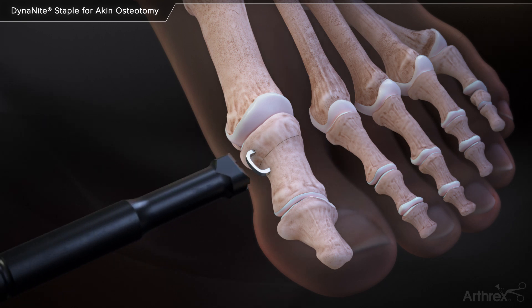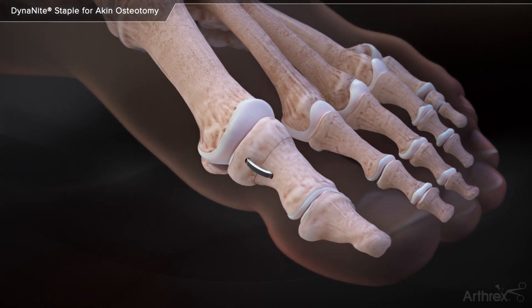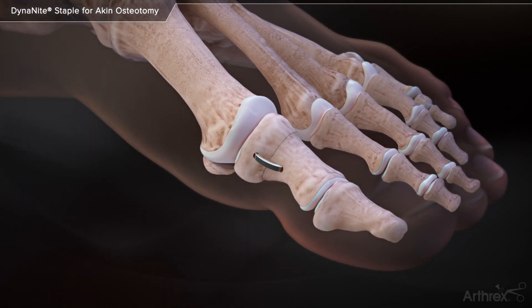The Dynanite tamp is used to fully seat the staple against the cortical surface. The low-profile Dynanite staple is seated flush to the cortical surface. The incision is closed and a compressive dressing is applied.